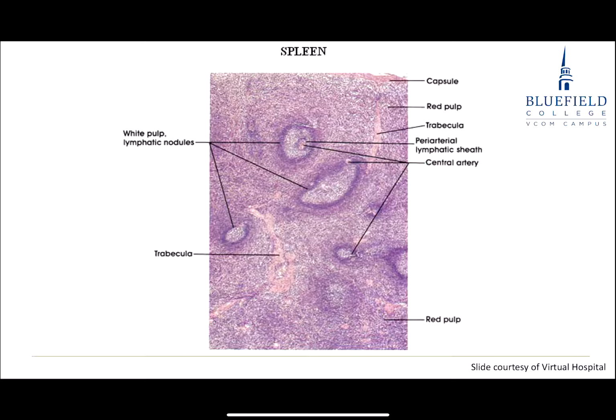Those lymphatic nodules, a little bit tougher on this one right here. I do see a tiny bit of things. I don't see the capsule. Yes, I do. Once again, why did they just show you a little tiny bit of capsule? Why not show more capsule coming across here? As the capsule's coming across, there is no subcapsular sinus. Okay? Doesn't get lymph, it gets blood, right? From the splenic artery. Okay? And so there's no subcapsular sinuses.